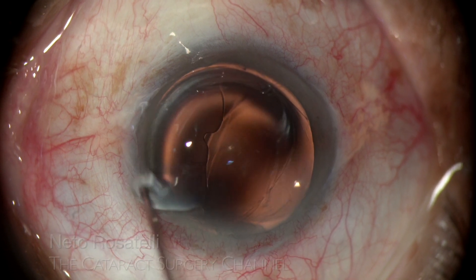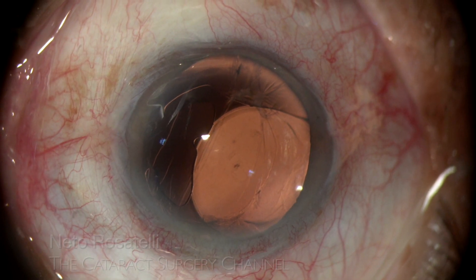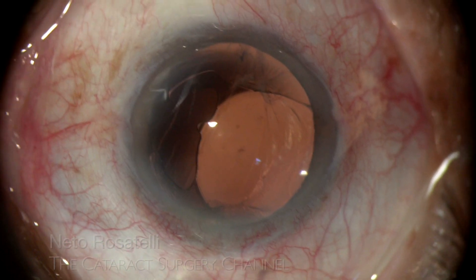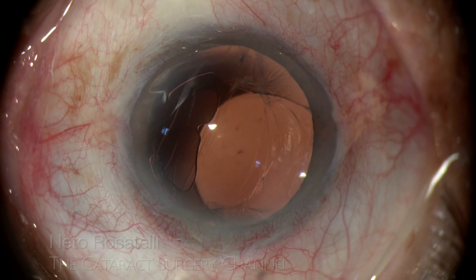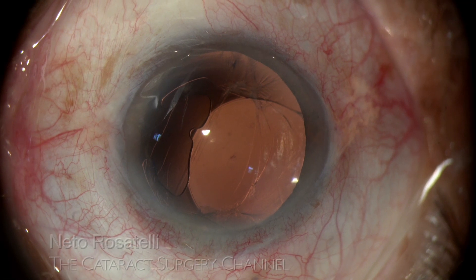This patient presented 4 months after uneventful surgery with a history of blunt ocular trauma 30 days after surgery and blurred vision since then. IOL dislocation was evident upon examination and IOL repositioning was scheduled.